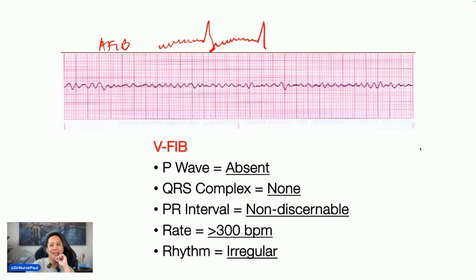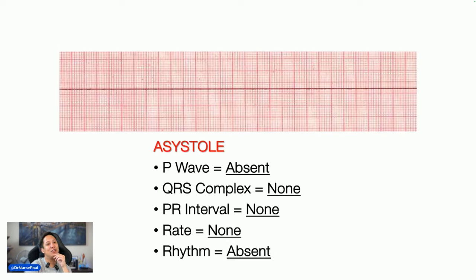Next. There's no pulse here. This is cardiac arrest, another form of cardiac arrest. Next one. You see this? That's not a signature line. Asystole, check the patient first. The leads might have been disconnected and the patient's actually breathing and sleeping. Nothing, nothing, nothing. What do you do first? This is also a form of cardiac arrest, but non-shockable. I'll teach ACLS in cardio lecture for my students. CPR first. We're going to focus on EKG right now.